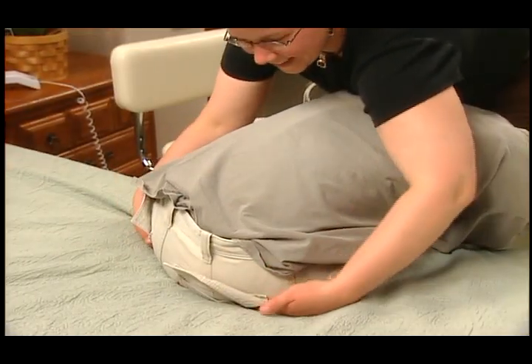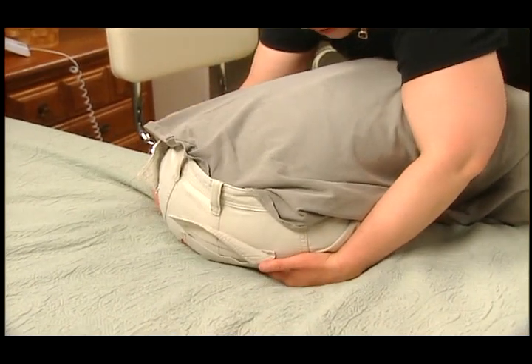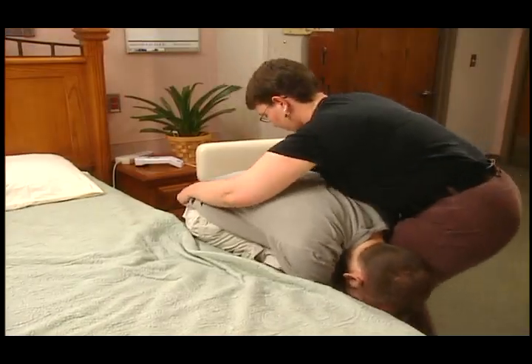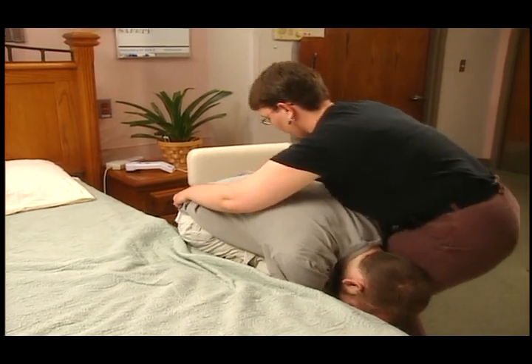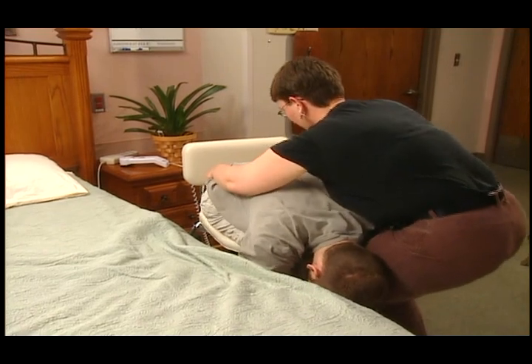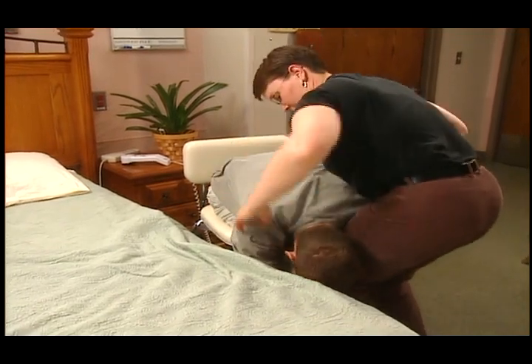The patient can also be supported under the buttocks at the ischial tuberosities, as shown here. The therapist then blocks the patient's knees and rocks the patient forward, lifting and placing the patient's buttocks closer to the transfer surface in small increments in order to reduce the chance for injury.